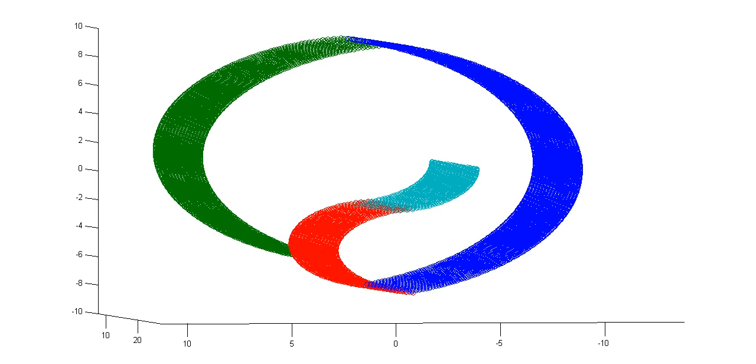So you're looking across voxels. You're essentially looking for maybe some distributed pattern. And in some ways this is related: if you looked at it at an individual voxel level, you would expect to see something in all of the voxels that are relevant. Here, you're trying to, in some sense, decode what is going on in the brain. Instead of asking whether this voxel relates to this signal, you ask, from all of the voxels in some brain region, can I predict something about my experiment or about the task?